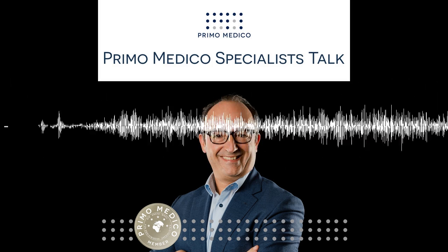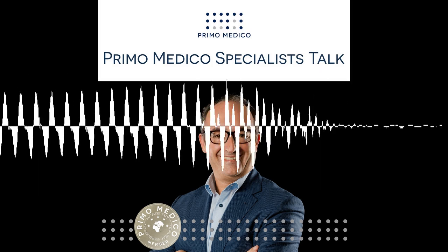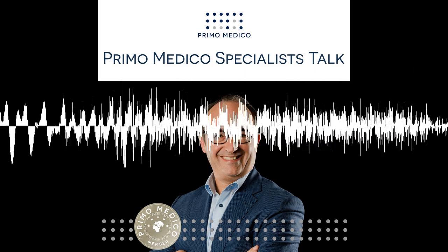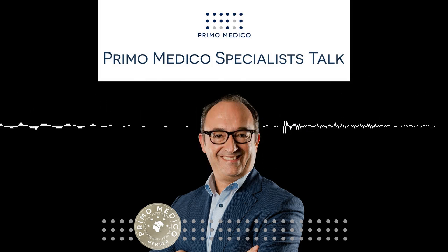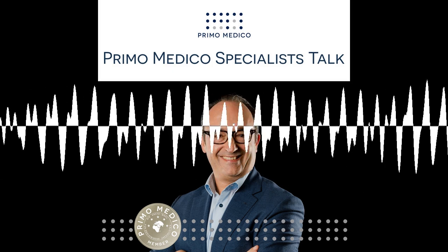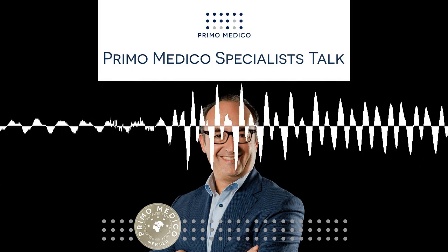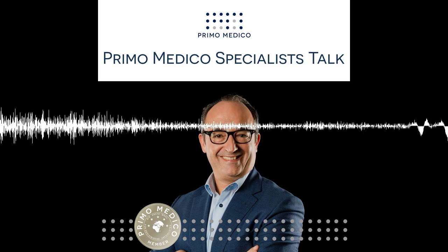When you talked about change or revision, how often is it necessary or possible to change the implant later in life? Well, it's the same principle as in the total knee arthroplasty or total hip. If the total ankle arthroplasty gets a loosening or a problem, we can nowadays avoid the fusion, and we can do partial or full revision of a total ankle arthroplasty.